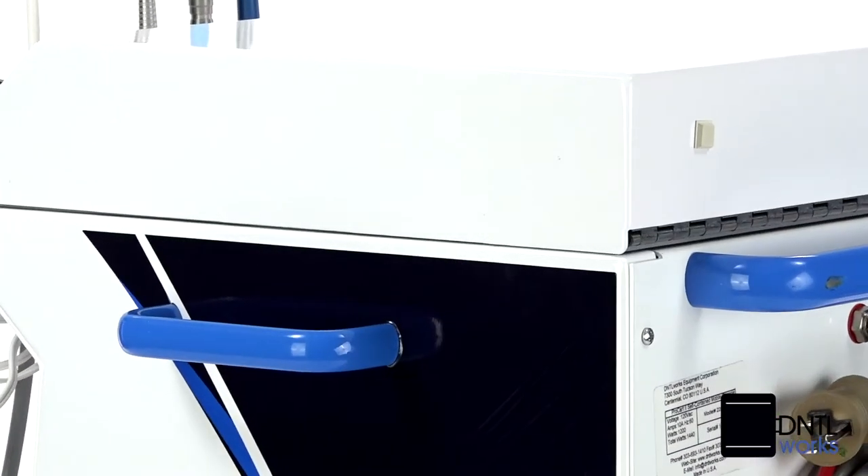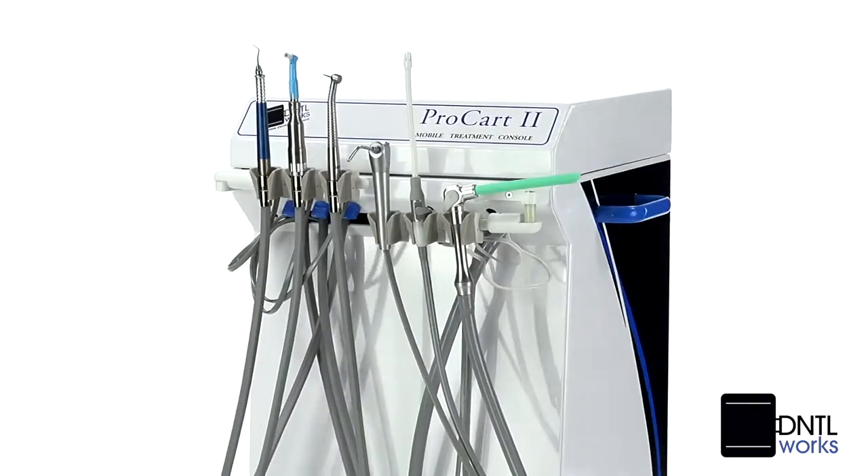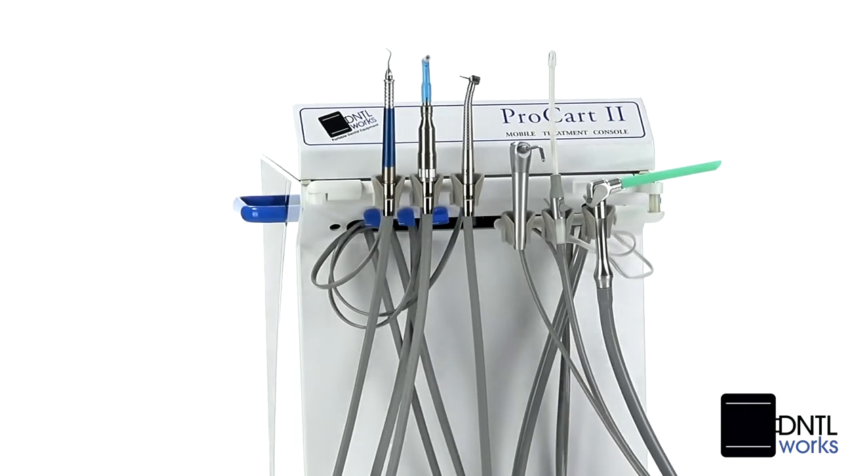Movement is easy, with side-maneuvering handles and high-grade casters. We incorporate high-quality American-made components into all of our designs.